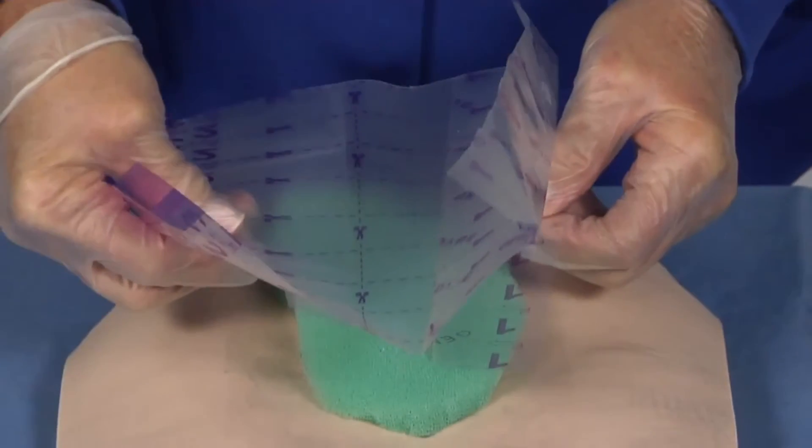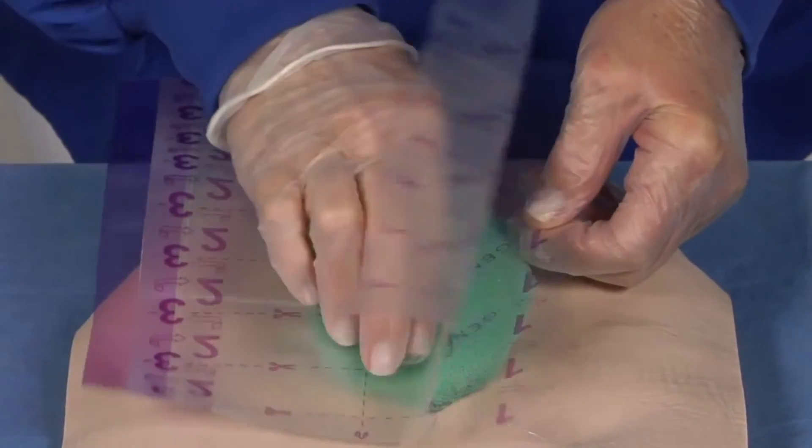Finally, apply the transparent dressing, leaving at least two to three centimeters beyond the skin edge.